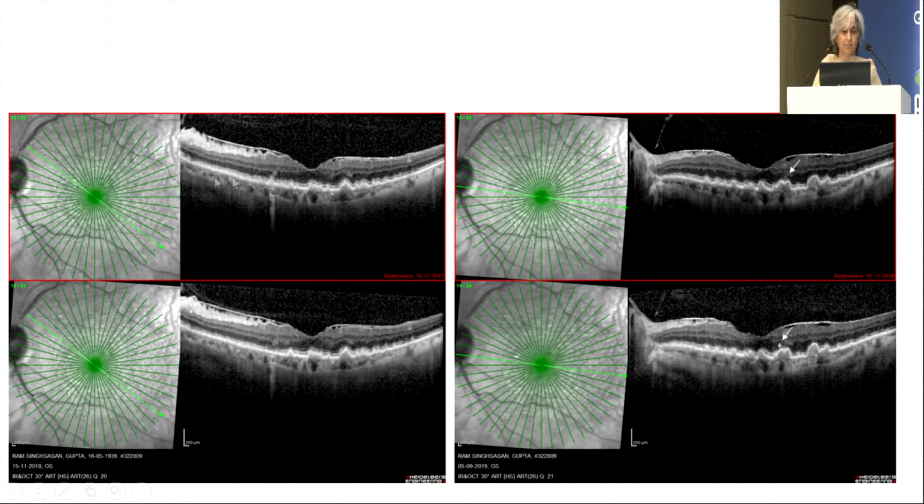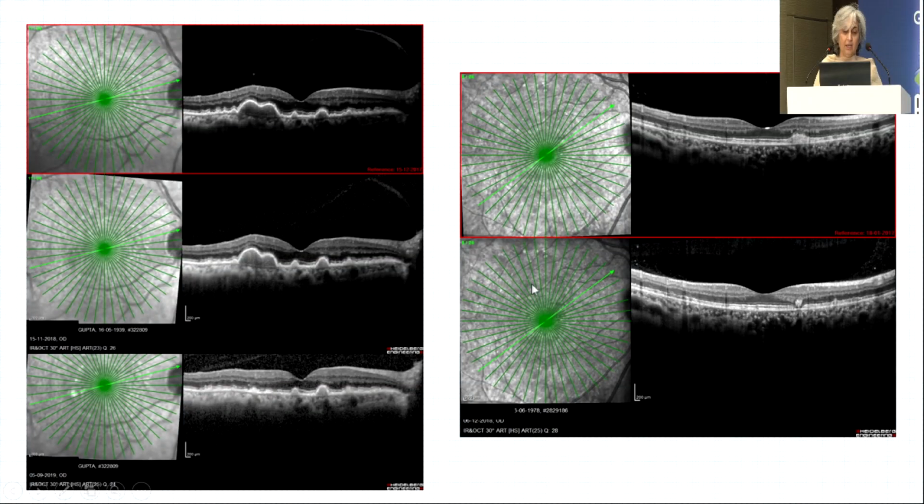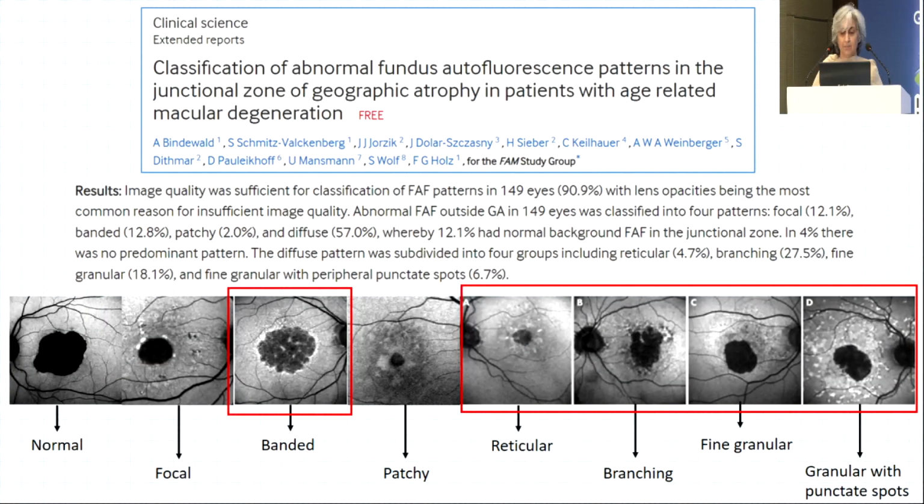Here you see this patient, you have some hyperreflectivity here, you have choroidal hypertransmission, and over a period of time you see there is atrophy. And this is another location, the same patient, another area where you see development of hyperreflective spots in the outer layer overlying the drusen, and you see over a period of time the drusenoid PED enlarging in size, it becomes larger and then it flattens down. This is another eye showing a little bit of hyperreflectivity that flattens down after a year. So these are changes that may be there somewhere in the fundus, and you need to have a careful OCT examination. What is more important is recognition of autofluorescence patterns at the junction of atrophy and normal retina.